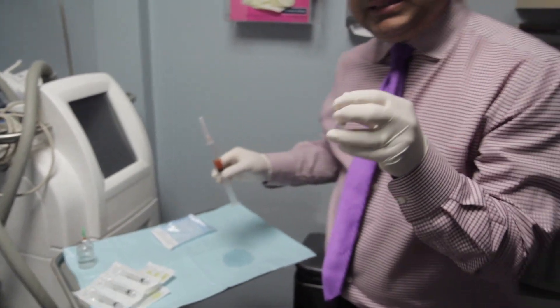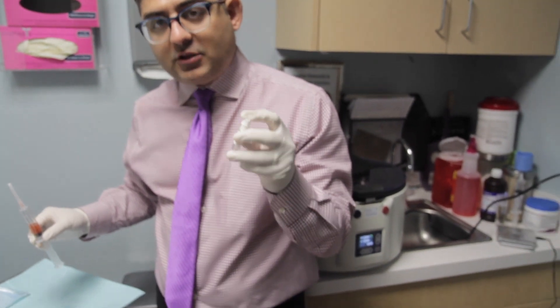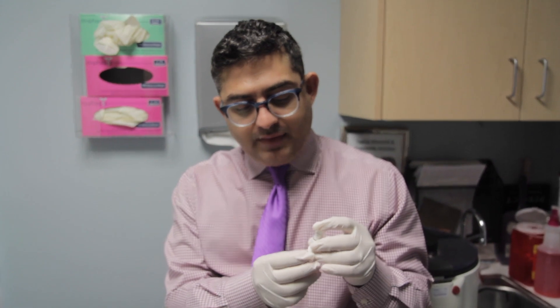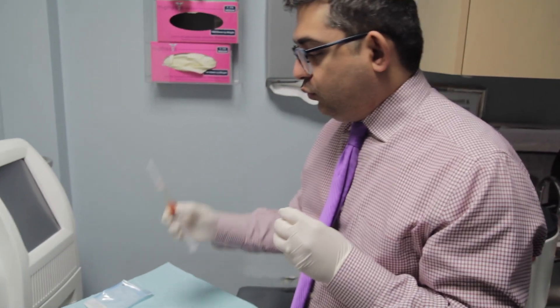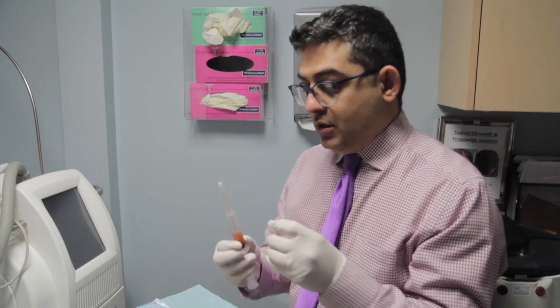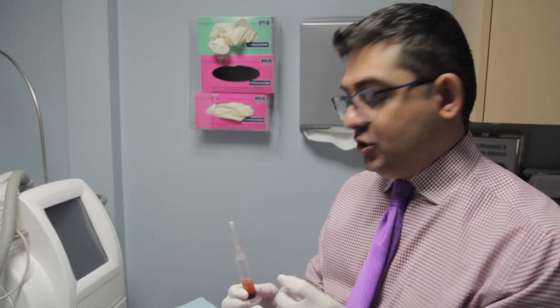This is the stem cell that we buy. The stem cells are called mesenchymal stem cells. They come from the human placenta umbilical cord from females that are 36 to 40 weeks gestational age. The company gets the placenta after delivery, and they purify it, they test it, and they concentrate the stem cells. We buy the stem cells and they come FedEx overnight to our office on ice. Once we have the PRP buffy coat from the patient, we mix these two together, and that's what I'm going to demonstrate right now.